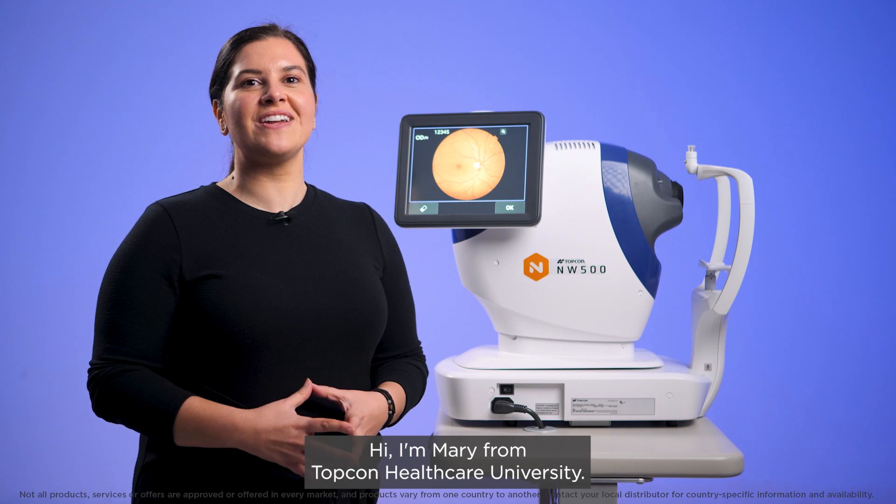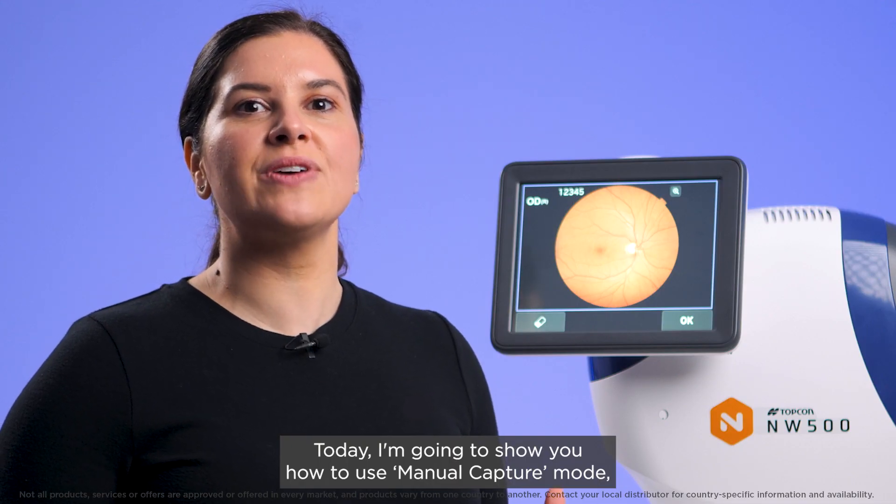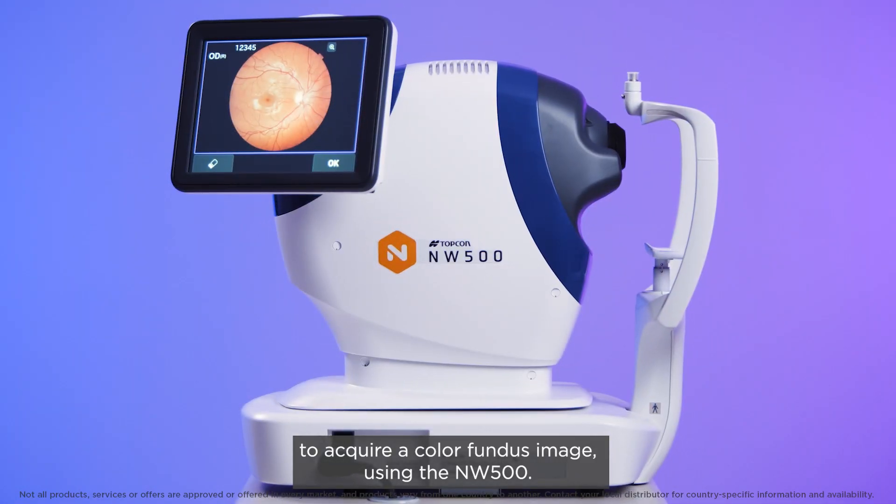Hi, I'm Mary from TopCon Healthcare University. Today I'm going to show you how to use manual capture mode to acquire a colour fundus image using the NW500.